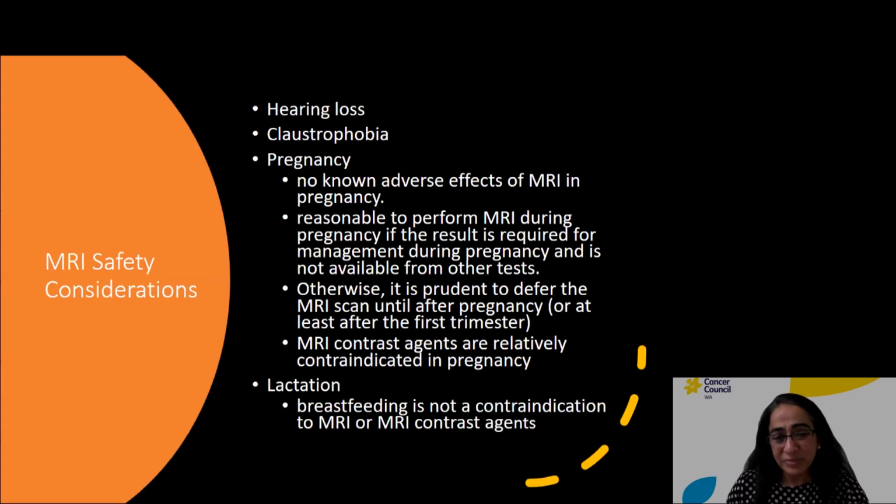Pregnancy, usually you would want to avoid performing MRI in the first trimester of pregnancy, though there are no known adverse effects of MRI in pregnancy. Usually it's prudent to defer the MRI scan until after pregnancy, or at least after the first trimester. And MRI contrasts are relatively contraindicated in pregnancy. Lactation is usually not a problem, and breastfeeding is not contraindicated to having MRI or MRI contrast agents.